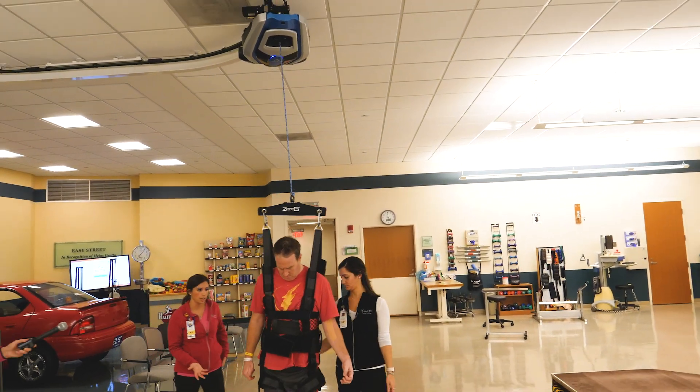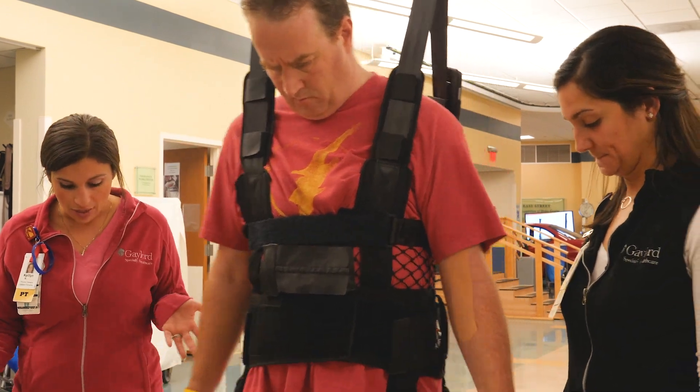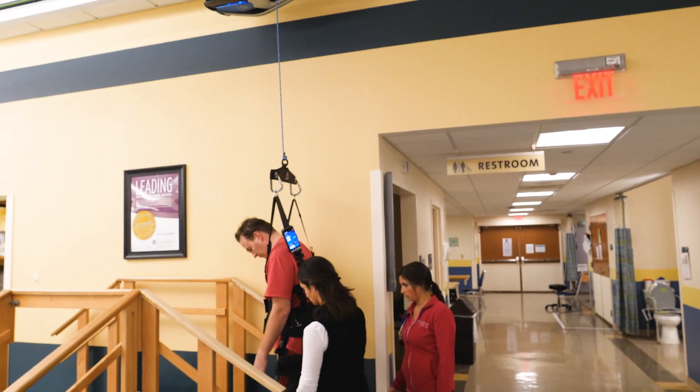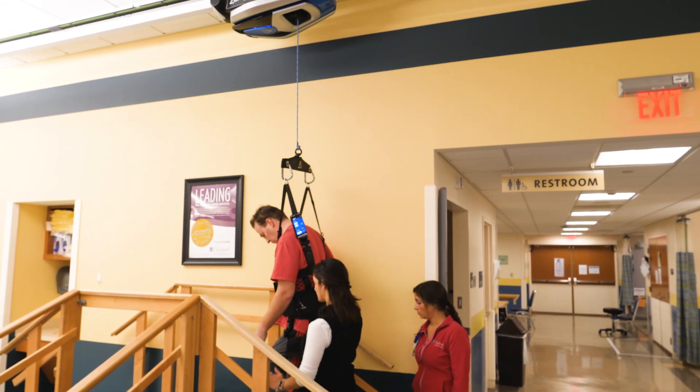The equipment helps us as therapists because we're able to get our patients up on their feet a lot quicker. We're also able to try things that we may not have tried before for safety purposes, but now we don't have to worry about the patient falling. Stairs can be a big challenge for patients, and a lot of patients have stairs to get into their home — this is a way for us to get them in the harness and really start working on those stairs early on.